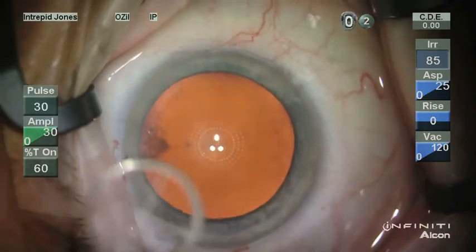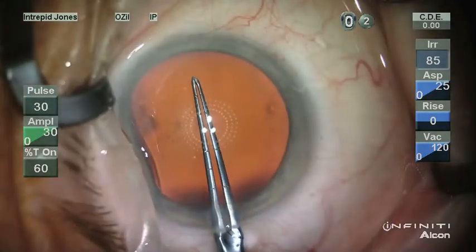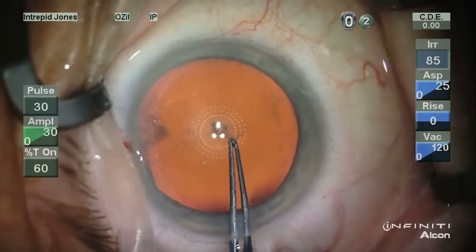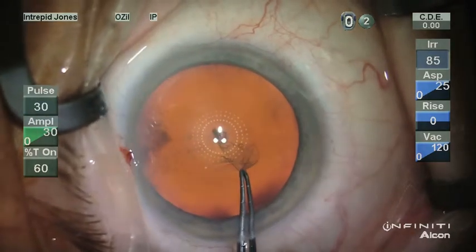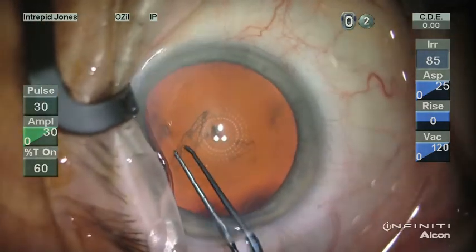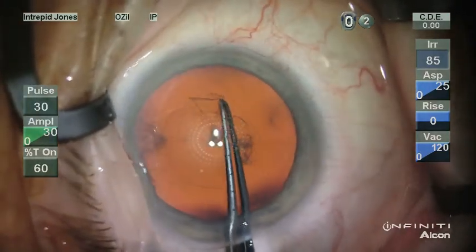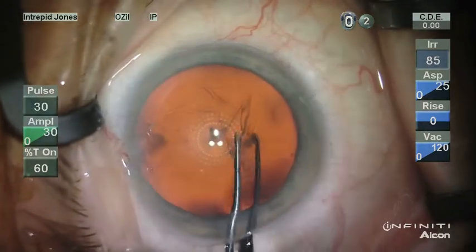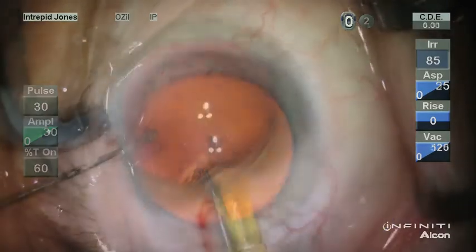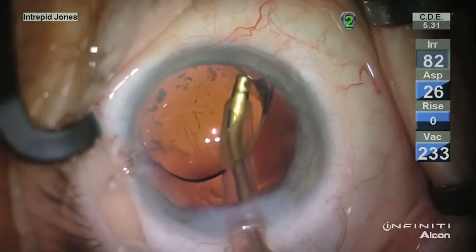Here's another application which is fairly common. Once again, the patient is asked to fixate on the blinking beacon. The marker is applied, and the utratas are used routinely to assess for corneal magnification using the inscribed 1-millimeter marks which go out to 6 millimeters along the backbone of the jaws of the forceps. This allows a very consistent sizing, as well as shape, of the capsulotomy, and the patient is able to maintain good fixation through this maneuver.